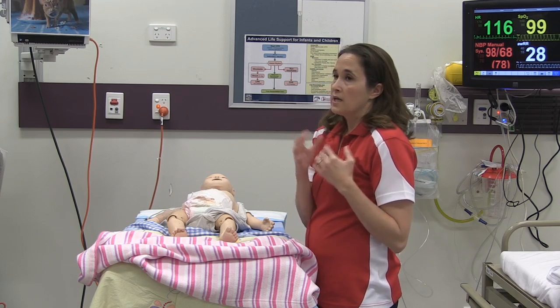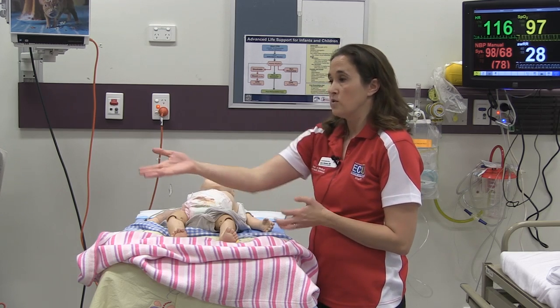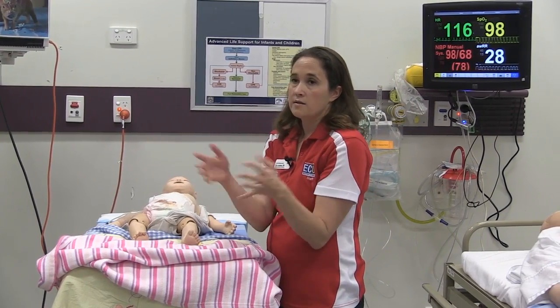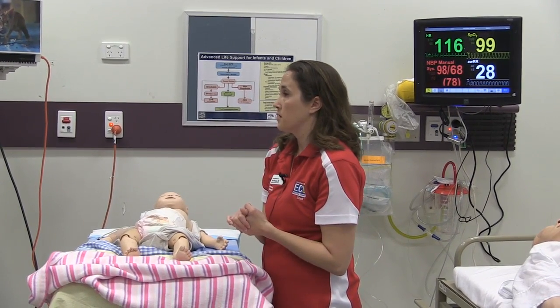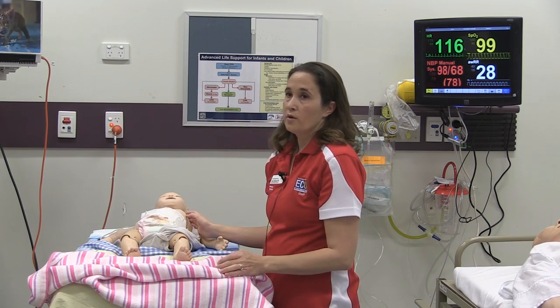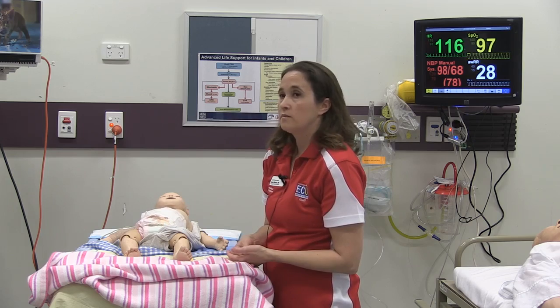So things that they're going to need on an immediate basis, you want at their disposal and easily accessible. And sometimes you can even put a resus kit out there, and it has the laryngoscope, and it has the endotracheal tube. So it's not like a treasure hunt finding this, that, or the other thing. It's really about the behavioral component. How do we focus in on a crisis? How can we improve and make ourselves more efficient in a crisis?